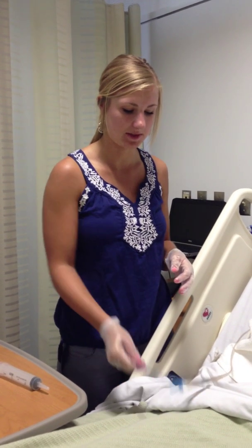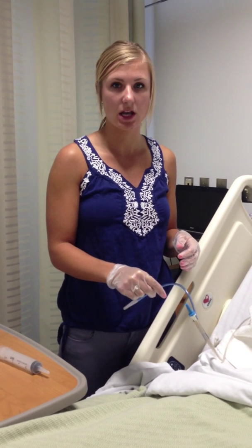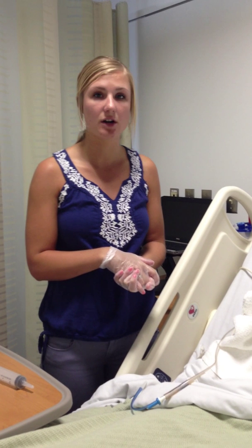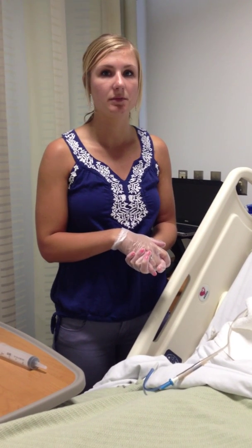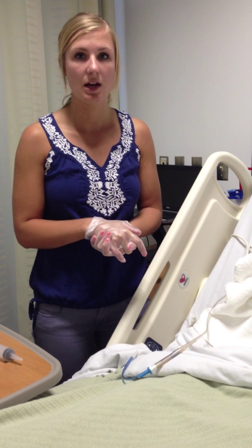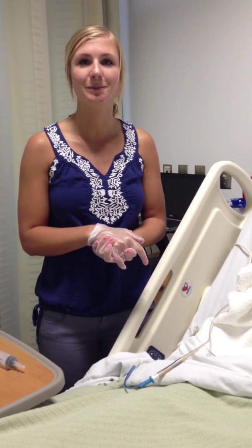I'd secure the tube to the gown once placement is confirmed. If the tube needs to be hooked up to feedings or medications, I can do that as well. I'd make sure the patient is in a comfortable position, leave them in high-Fowler's position, and offer oral care every 2 to 4 hours. And that is how you insert an NG tube.